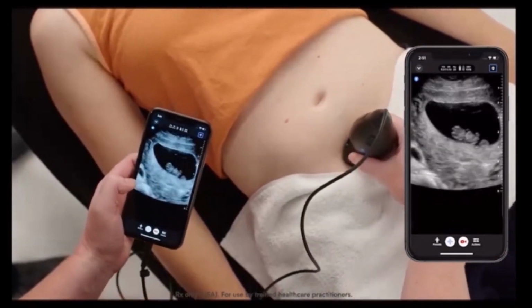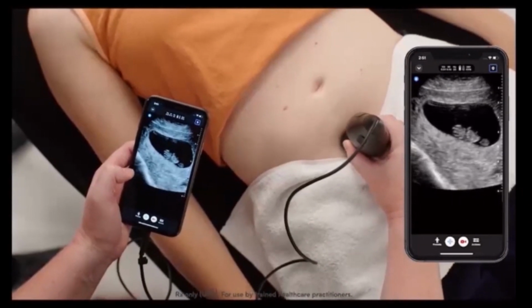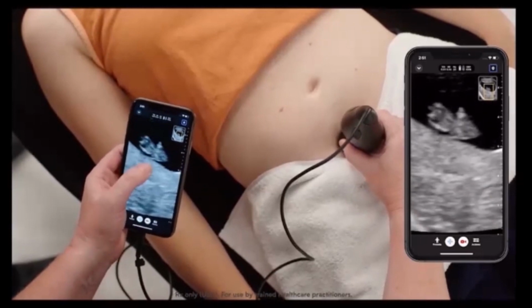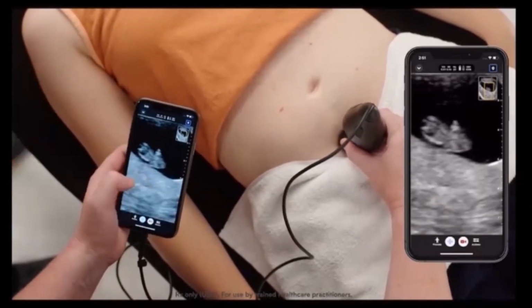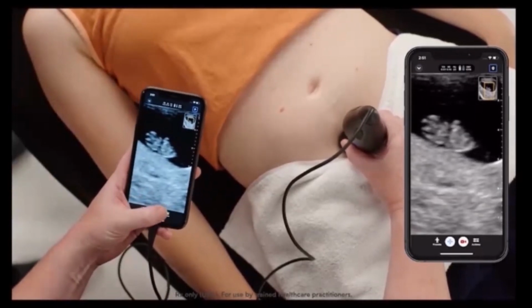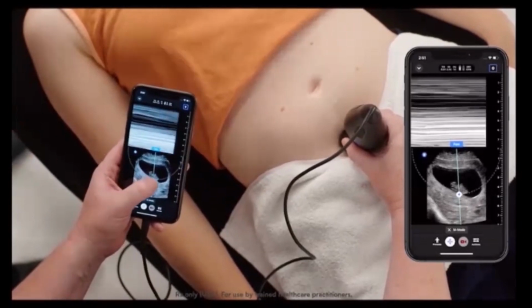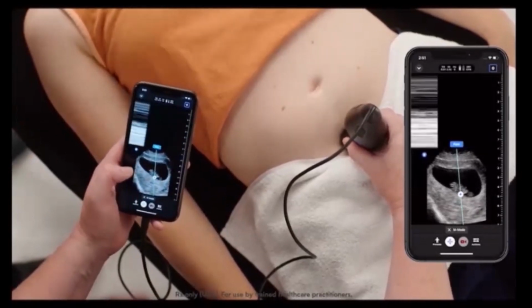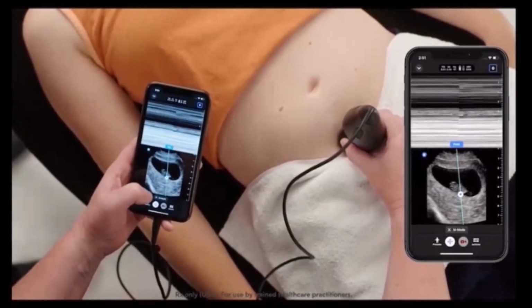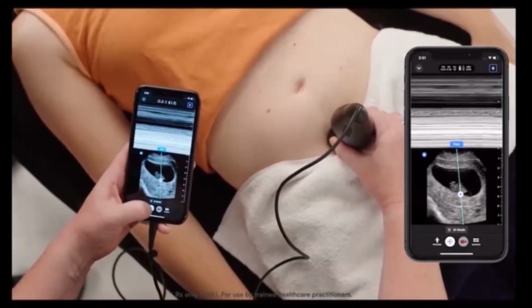And I'm just fanning through here to locate the motion of the heart. And double tapping there just to zoom in, and we can see fetal heart motion right in the center of the screen. So from there we'll use M mode by going to the Actions tab and activating M mode. And we can reposition the M mode cursor or spike as needed to intersect the fetal heart motion. And then we're seeing periodic repetitive signal on the screen representing fetal heart motion over time.